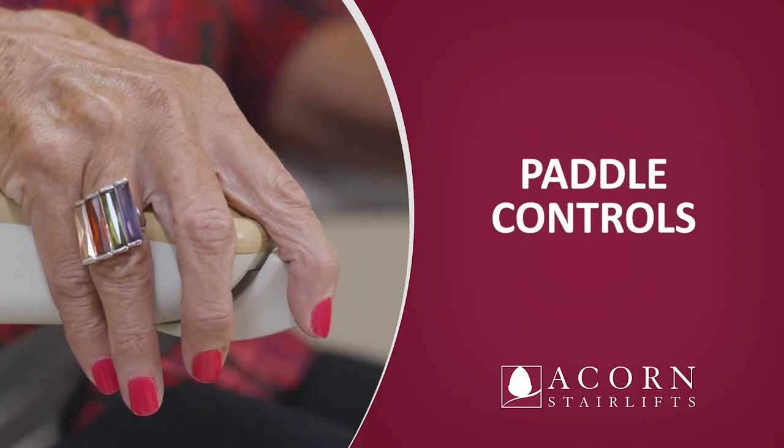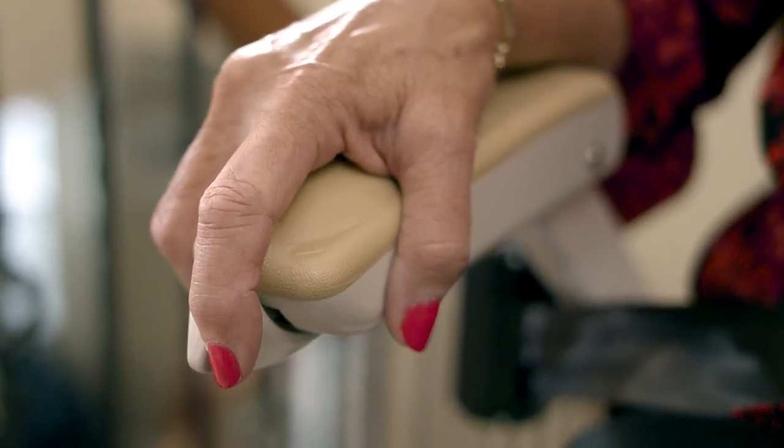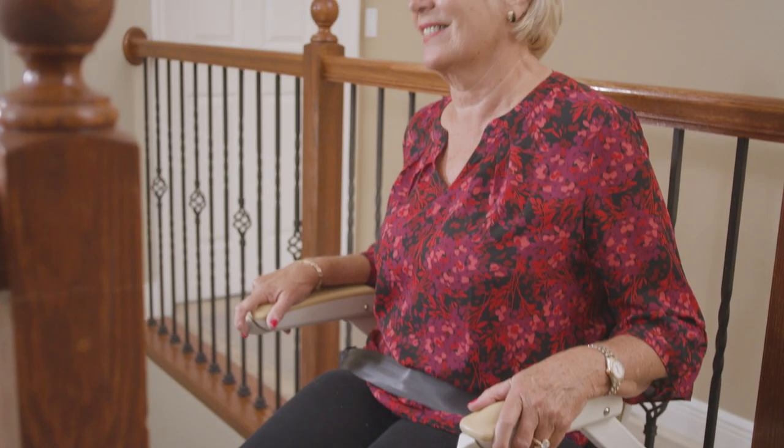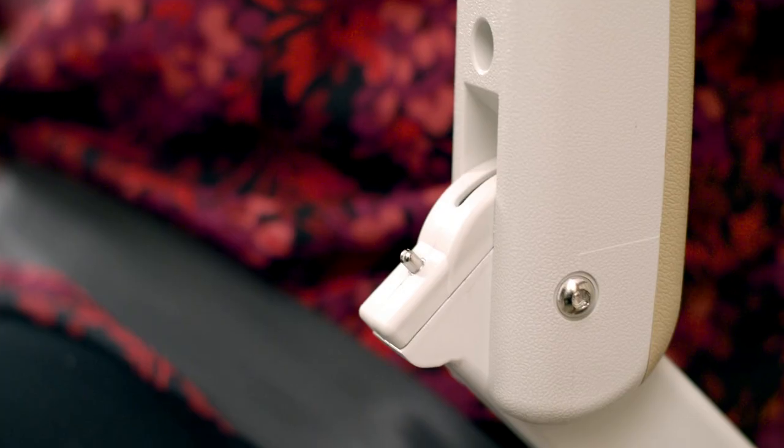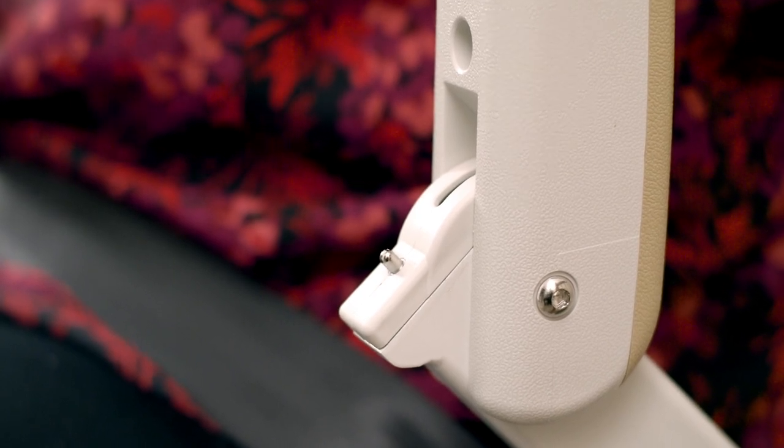Paddle control. There is a paddle control located on the end of each armrest. To operate the unit, the paddle must be pressed and held in the direction of travel. There will be an audible beep to signal that a command has been received and a momentary delay before the stairlift will operate. The unit will only operate while the paddle is being pressed and will automatically stop when the unit reaches the end of the track or the paddle is released. Both armrests must be fully down in order for the stairlift to operate. You must maintain continuous positive pressure throughout the trip.